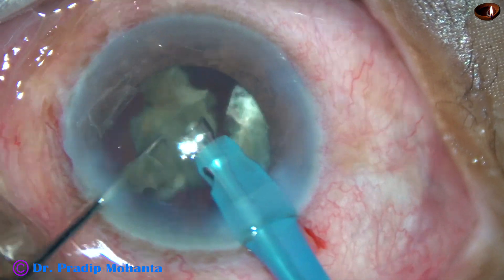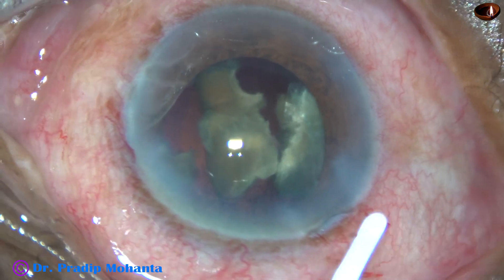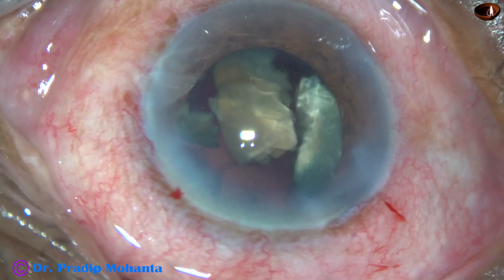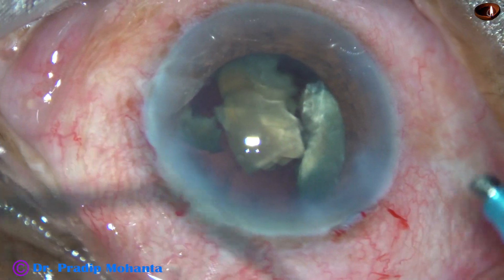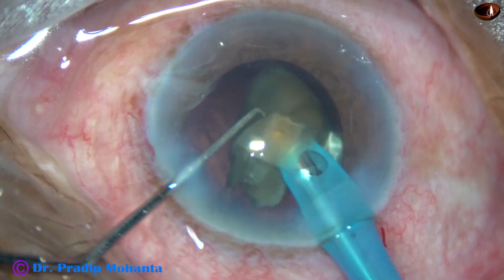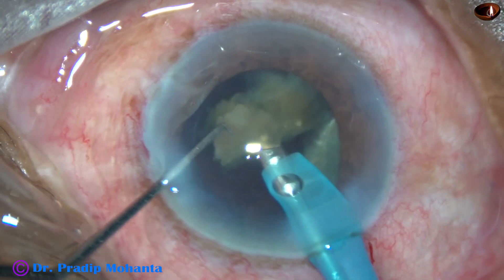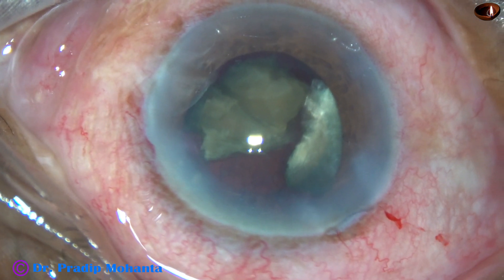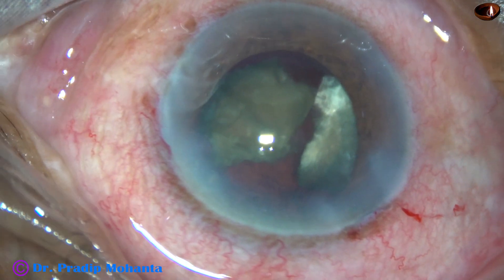This is a hard cataract. Ultrasonic energy used is 80%, flow rate is 40 ml per minute, vacuum is 400 mm of mercury. My plan is to emulsify the piece at 9 o'clock. It is in the bag because the rhexis is not very large — about 5.5 mm. I am emulsifying this piece and then come out. I don't want to over-emulsify because the posterior capsule may be caught anytime. Though the zonule didn't appear weak, I am taking all these precautions.